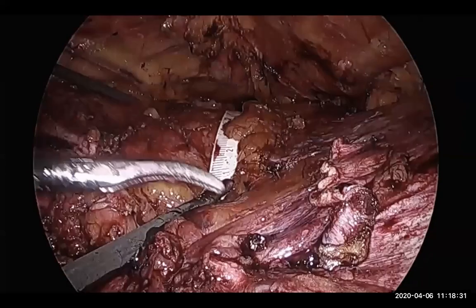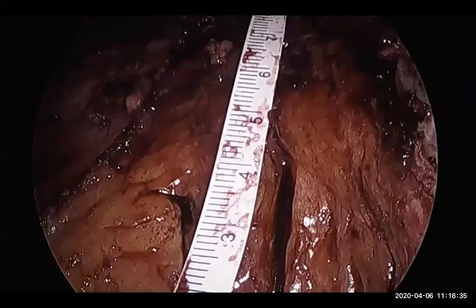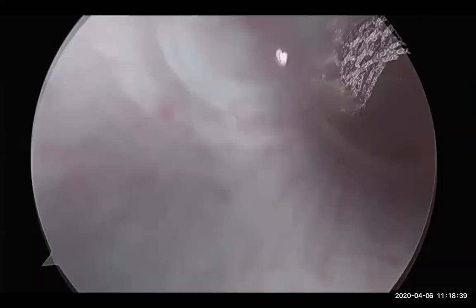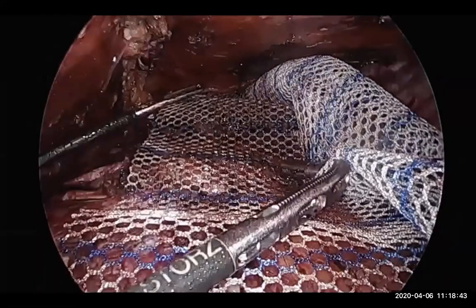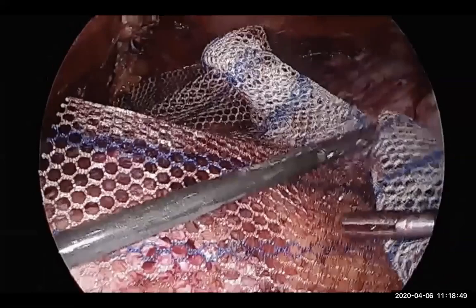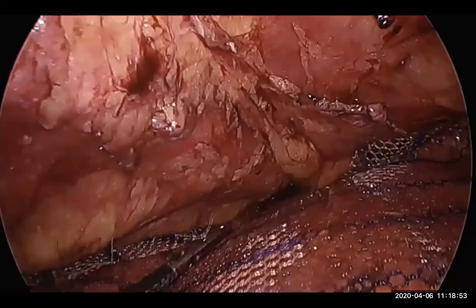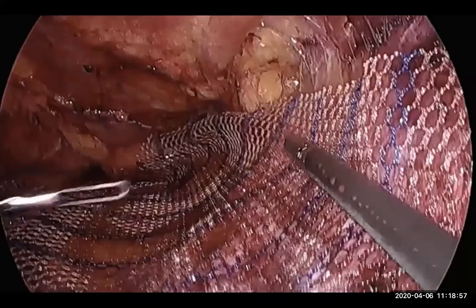So you have to do the measurement in multiple levels. And typically, you would need at least a 23, 24 centimeter length, if not 30, 36 centimeters, depending on the patient's height. And the width is minimally around 14 centimeters and may go as much as 17 centimeters or so. So standard macroporous polypropylene mesh is used and may not be fixed at all.